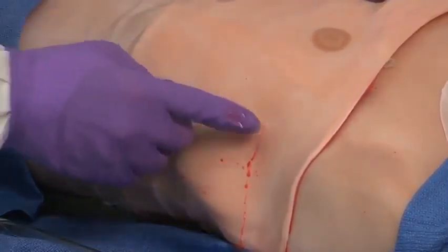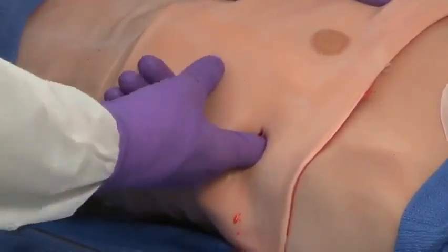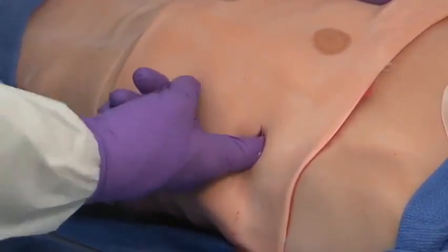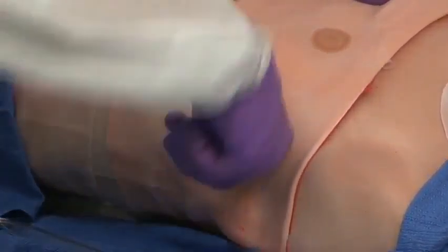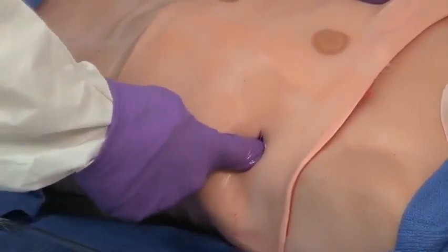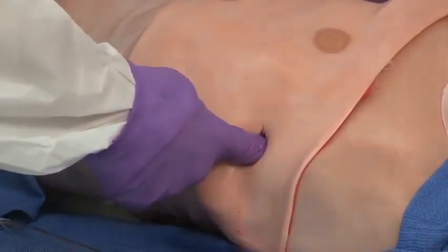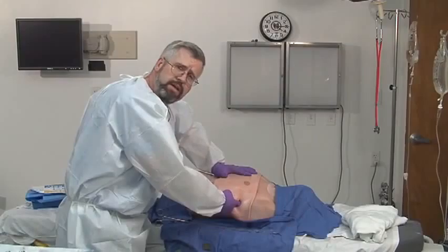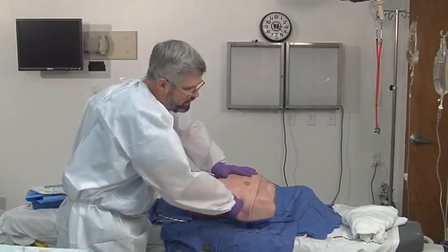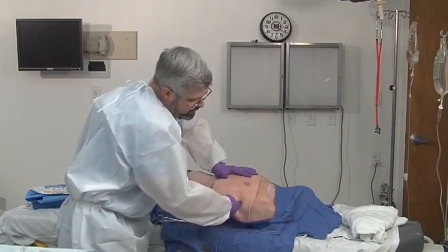The next step is to put my finger into the chest and confirm, number one, I'm in the chest. In the patient, you should be able to feel the lung up against your finger. Also, the reason for putting your finger into the chest is to sweep your finger around inside the chest to make sure there's no lung adhesions with the lung stuck up against the chest. Even if the patient has a pneumothorax, he can still have adhesions up against the chest wall, and you can cause additional damage to the lung if you don't sweep down these adhesions. So now we've confirmed we're in the chest. We can feel the lung under our finger.